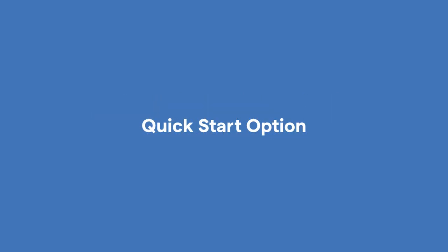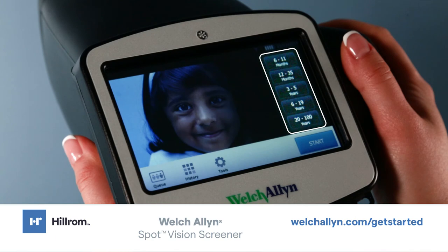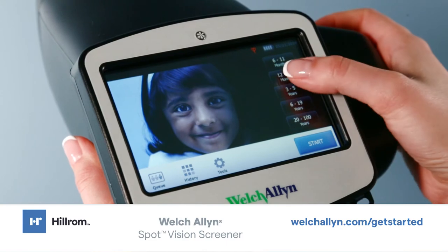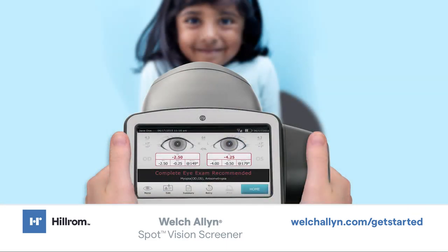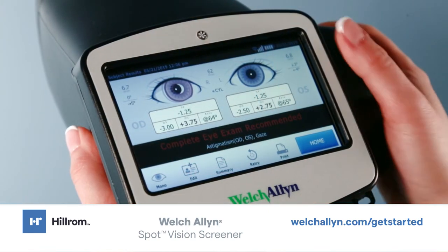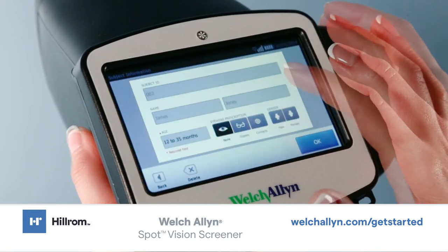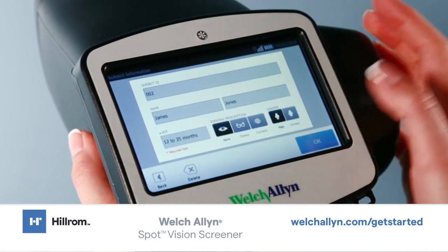Quick Start option: Select the age range of the subject and the screening begins immediately. The subject results screen appears at the end of the screening process. Select Home and choose if you want to save the subject. If saving results, enter the subject information as covered earlier in this video.